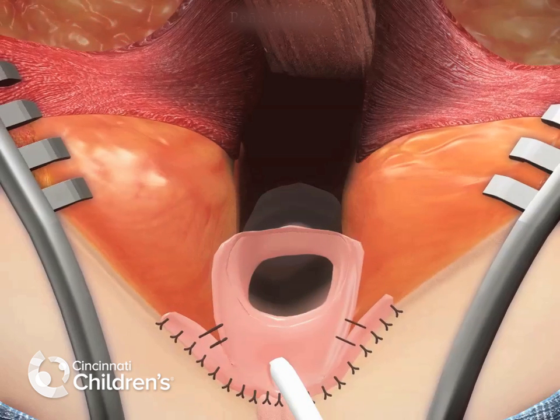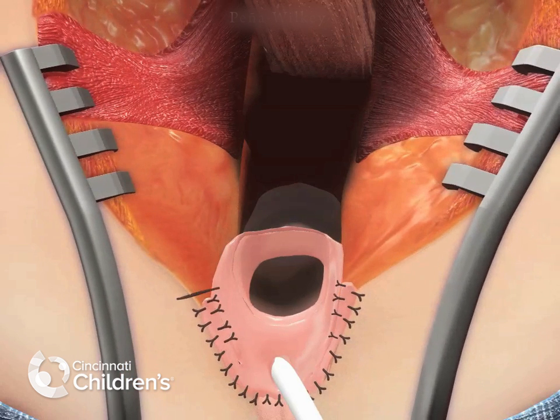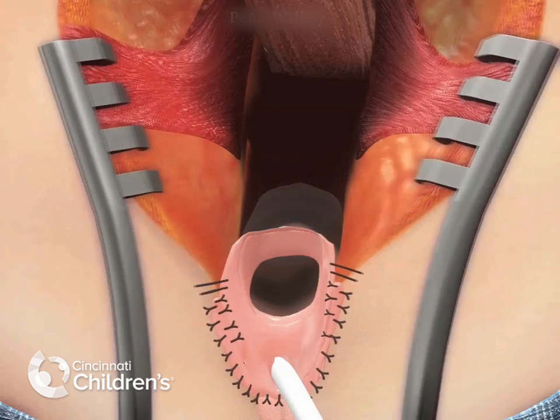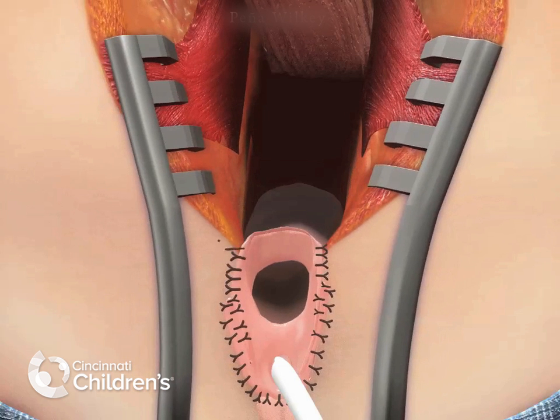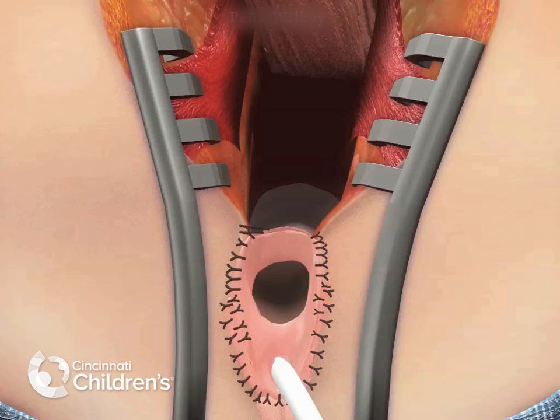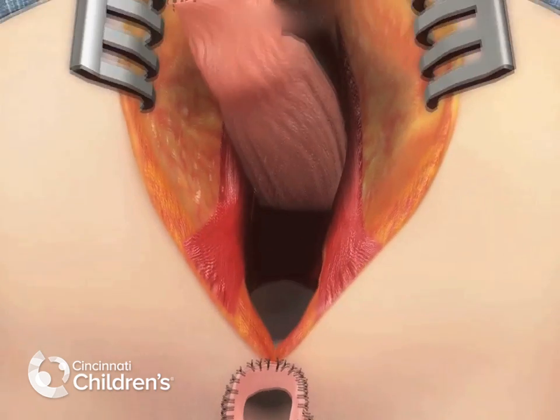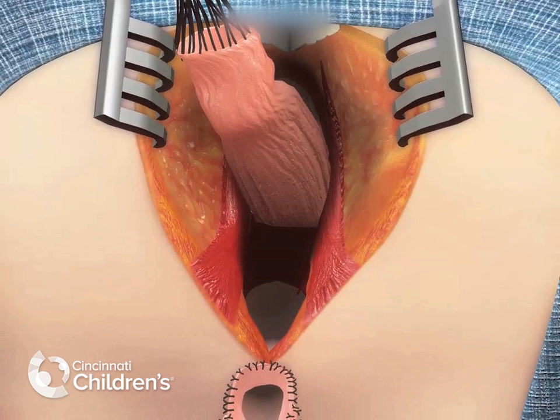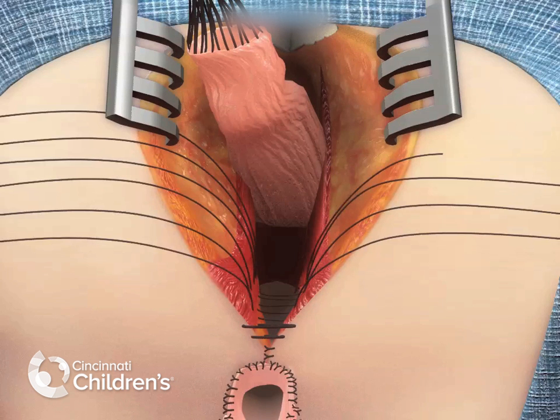and here you see the introitoplasty portion of the cloaca repair, where multiple interrupted sutures are placed as traction is released to create the vaginal introitus. At this point, the introitoplasty is complete and the perineal body is closed up to the anterior limits of the sphincter. This is performed with multiple layers of long-term absorbable suture.